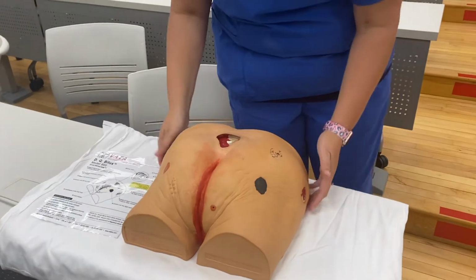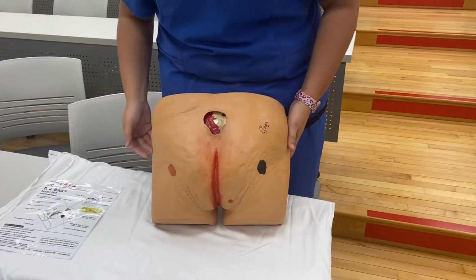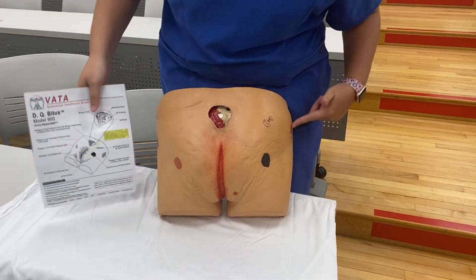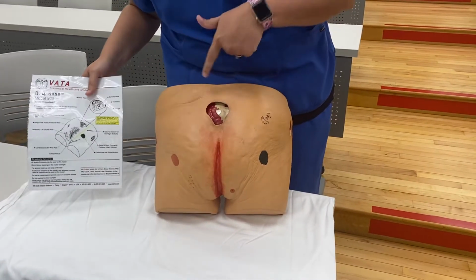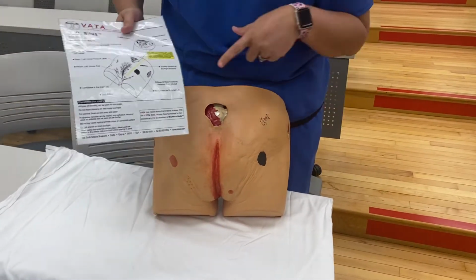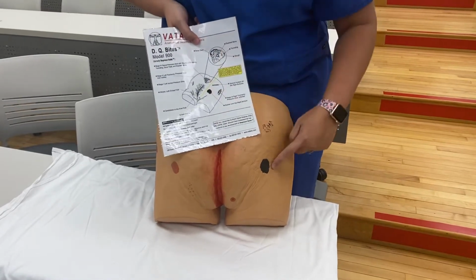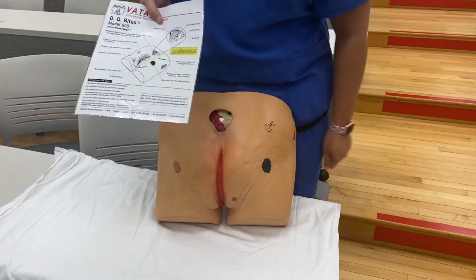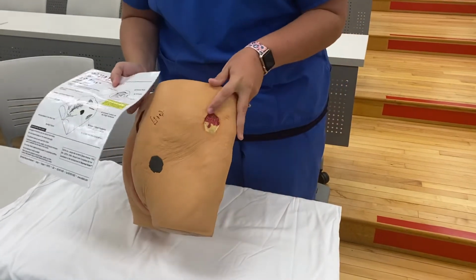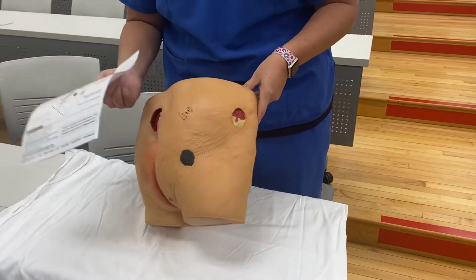So what I love about these is on these, so this one is a booty mannequin, and so you can look at him, and we even have this handout. So you're looking at different wounds on him and different issues, and you're like, oh my gosh, what is that right there? Well, you just come over to this handout and it points to it and it tells you that is some eschar tissue that he has going on, okay? I can even turn him to the side and he has a stage 3 pressure ulcer on the side, okay?